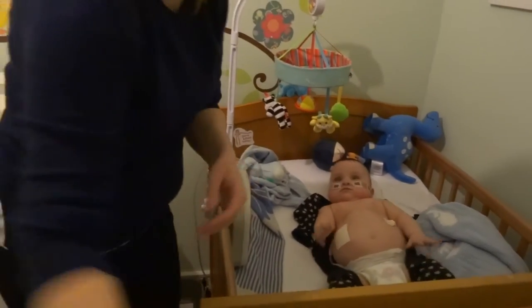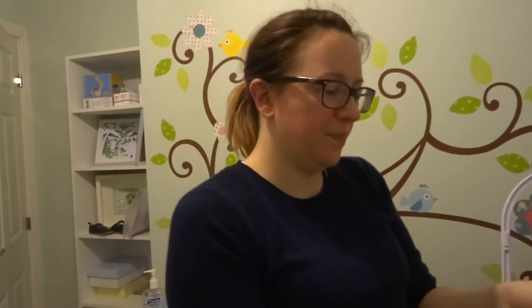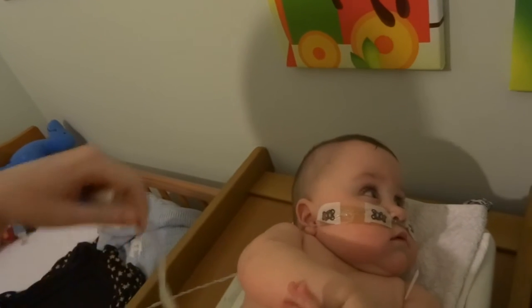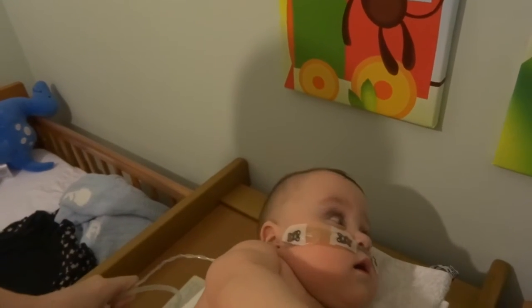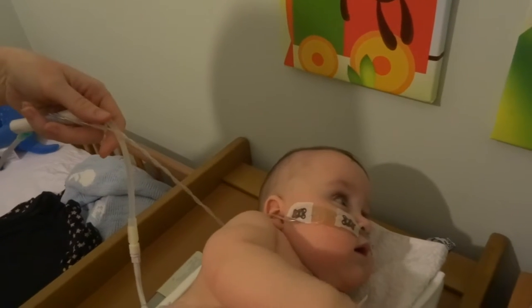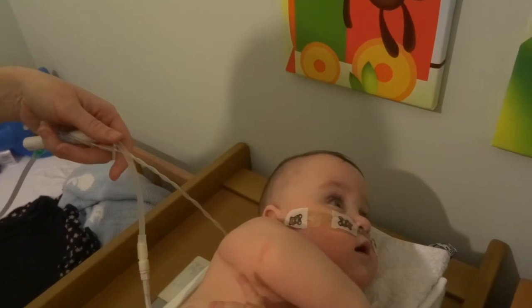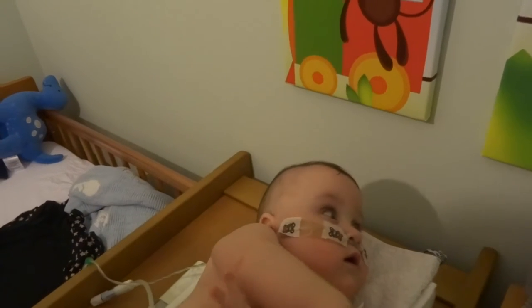I'm just going to change his nappy so we can get him weighed. Let's pop Ethan up here to weigh him — I'll focus on the head end to keep his modesty. I have to hold up all his lines just to make sure they're not adding any extra weight. He quite likes being up here; he gets a different view of his bedroom.